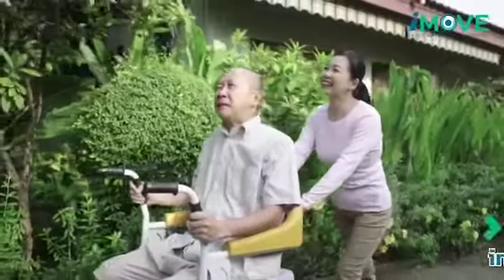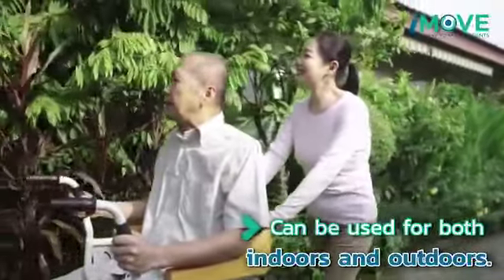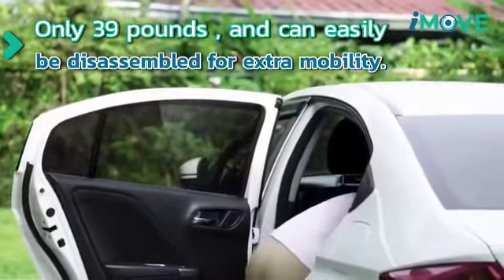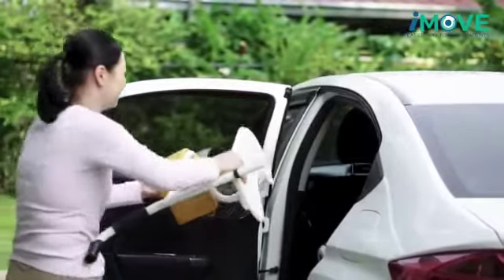The wheelchair can also be used to move the patient outdoors to many different places. Moreover, the wheelchair is very light with a weight of only 39 pounds. It can be easily taken apart and used outside the home for many types of activities.